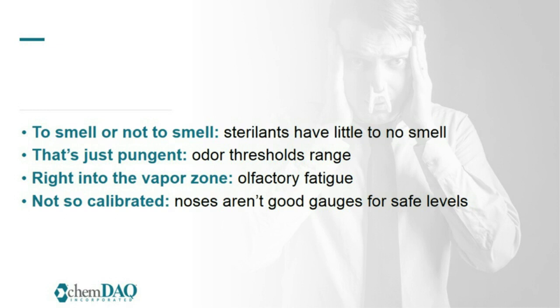Come on now. We know how crazy it is in sterile processing, so coupling this busyness and hecticness that goes on in our department with allergies and running around, our noses are going to get tired and we're just going to get used to these smells. So not so calibrated. Noses aren't good gauges for safe levels.